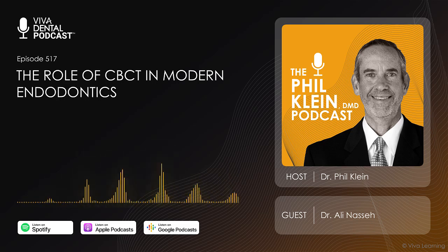And the question was always, well, why didn't the root canal work? Now with CBCT imaging, when you look at the axial section, the cross section of the root, you see what Vertucci and the other anatomy people had shown us: a good 10 to 20% of these can have multiple canals. And when they do have multiple canals, when you end up having a separate exit, you'll end up only treating one buccal aspect of the tooth.